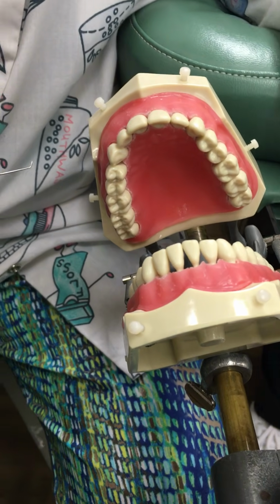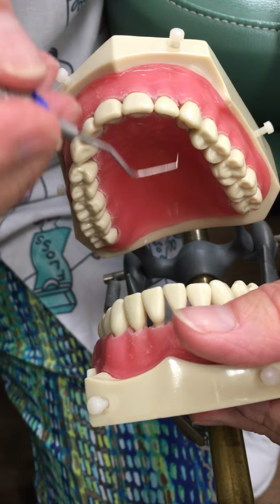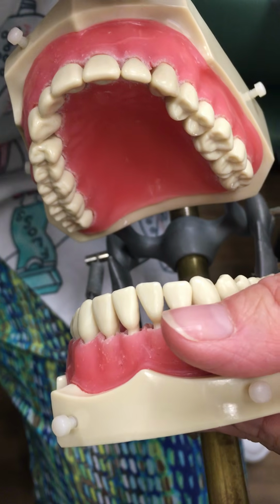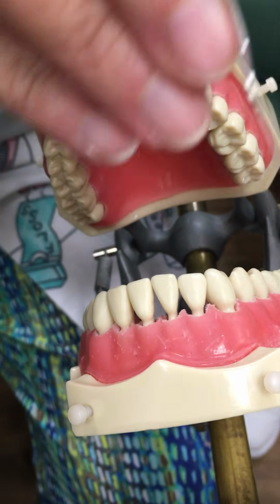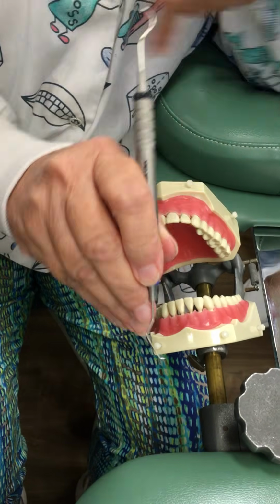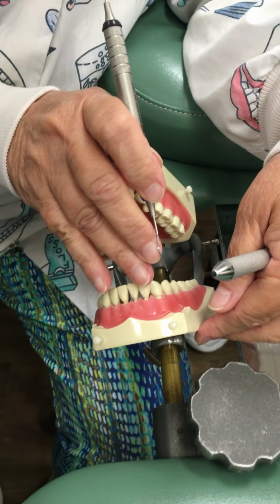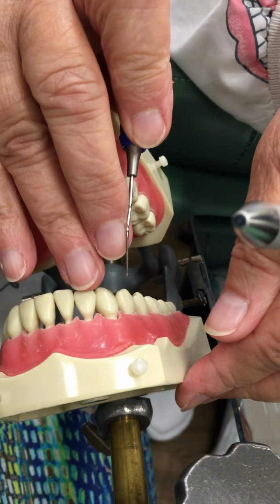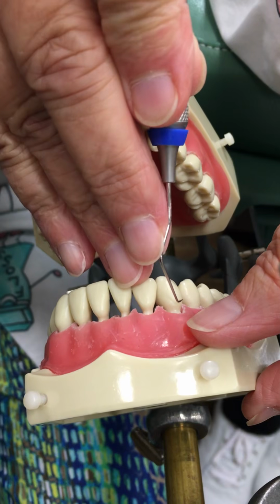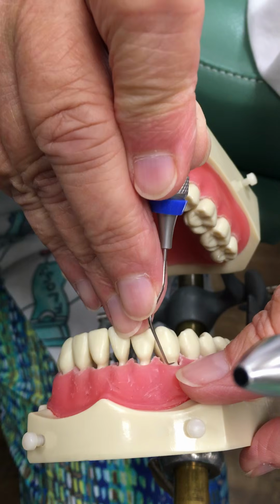We're still palming our mirror, and we're going to retract the lip now with our thumb, modified pen grasp, and we're going to come down, elbows in close, and wrist kind of bent like this. So everybody do their wrists like this. And we're going to come down over the maxilla and stretch our fulcrum down on the tooth next to the one that we're going to be working on. We're going to start at the midline.